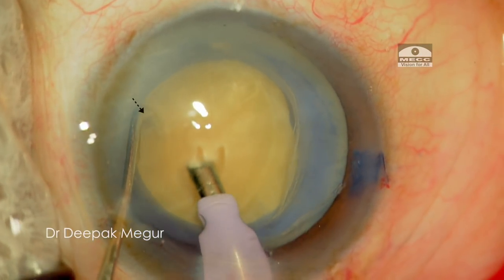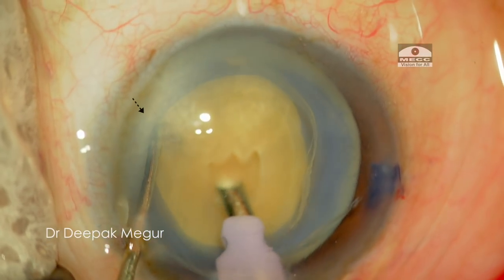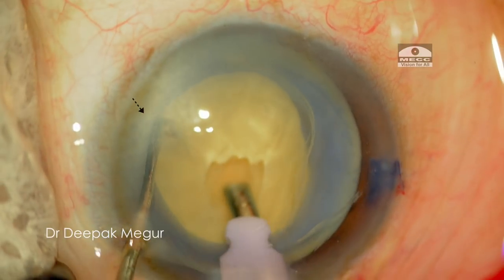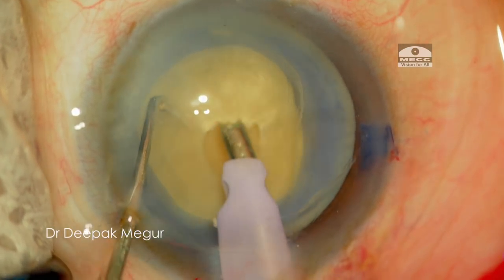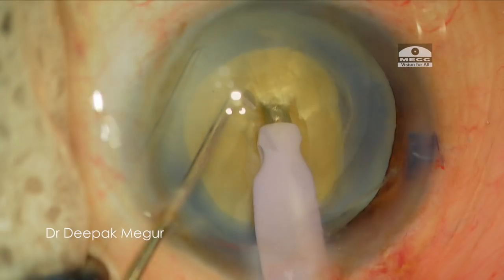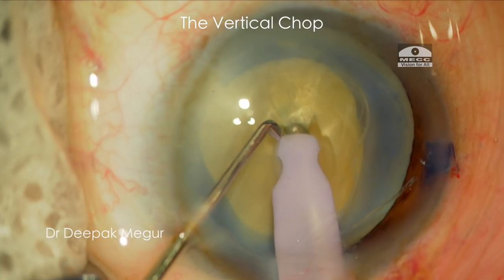To work around this problem, the first thing I do is to sculpt out a small central area of the nucleus. While doing this, I am stabilising the nucleus with my second instrument to achieve this small trench. The whole idea of creating this small trench is to be much more nearer to the central core of the nucleus, which could help me to achieve a firm grip.